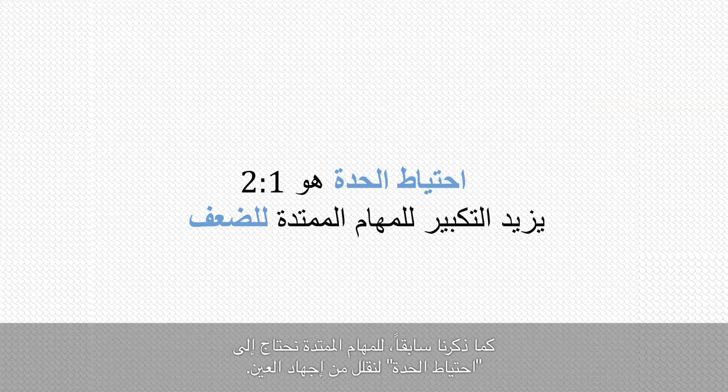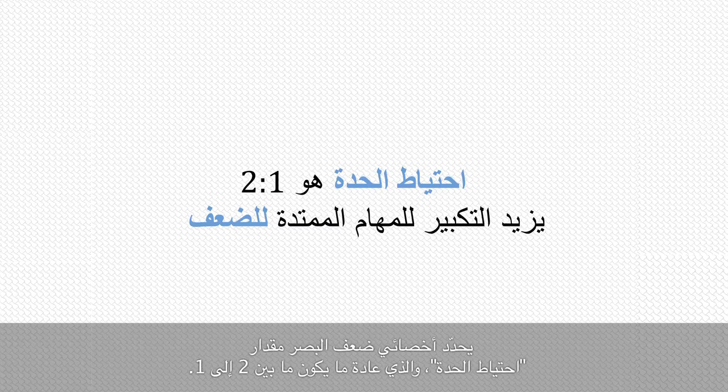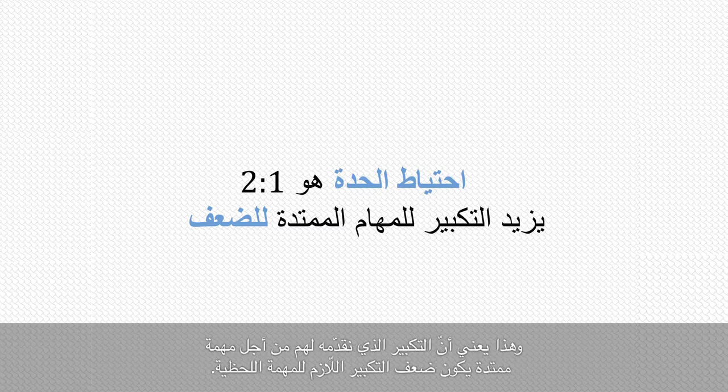But as we mentioned earlier, for a longer sustained task, we need to leave an acuity reserve to reduce fatigue. The amount of acuity reserve is left to the practitioner, but normally we'd leave a reserve of about 2 to 1. And this means for a sustained task, we'd give them double the level of magnification to the spot task.